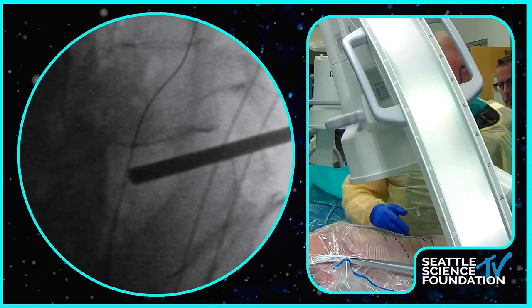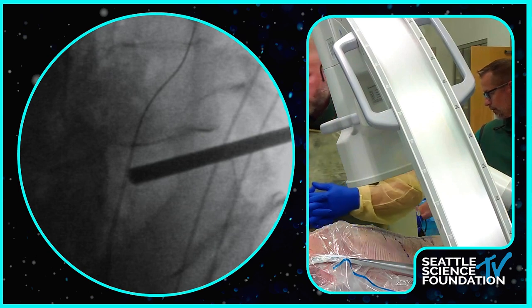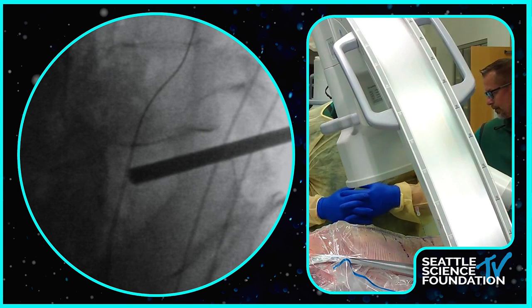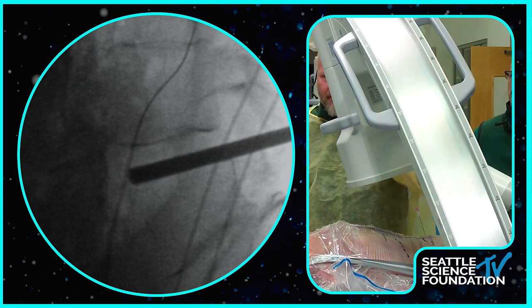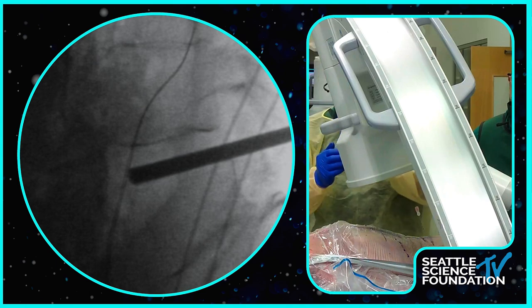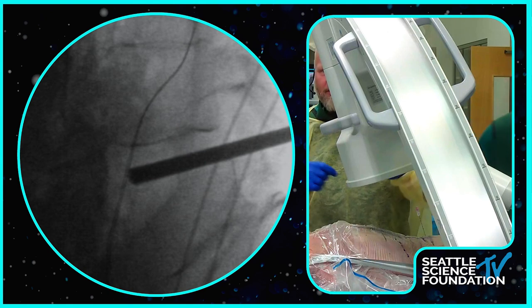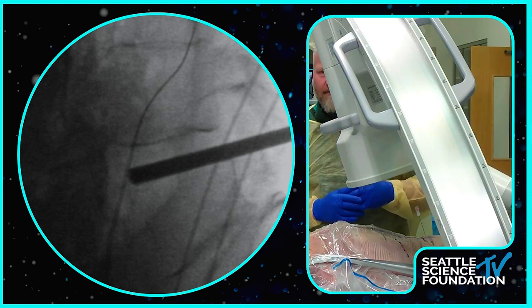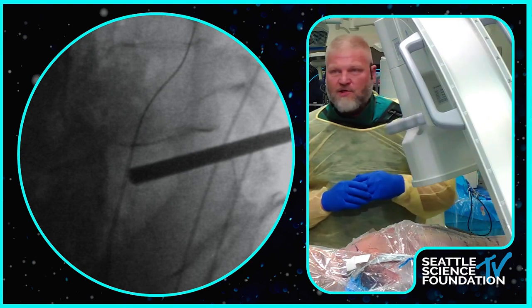So how do you mark your lateral entry point for this transforaminal approach? Like the actual place where you put the needle in? Yeah, so I planned that out on the MRI. I plan a trajectory for where I want the foramen decompressed and where I want the implant to end up, and I'll show that in my lecture. I've got a little animation that shows that, but right now we're just sort of guessing here.